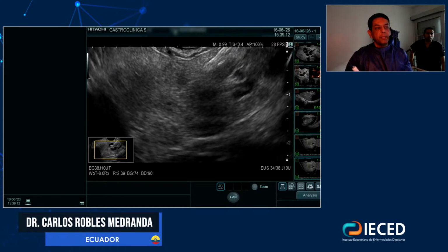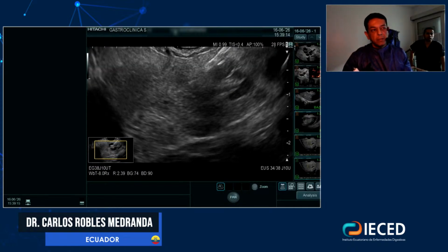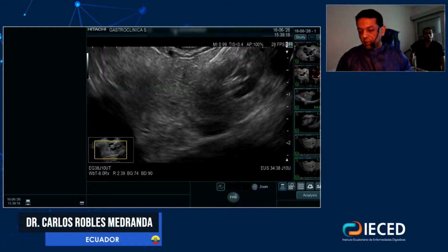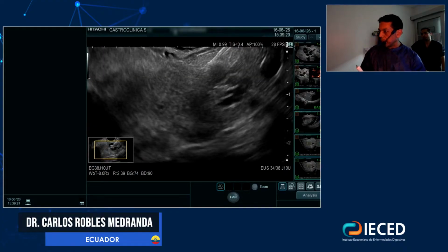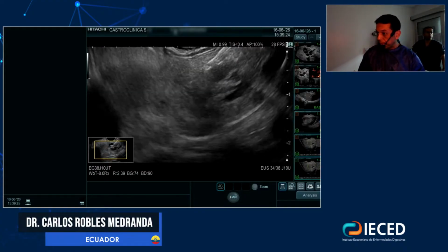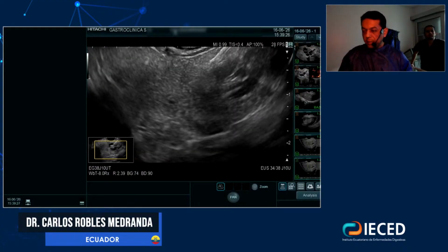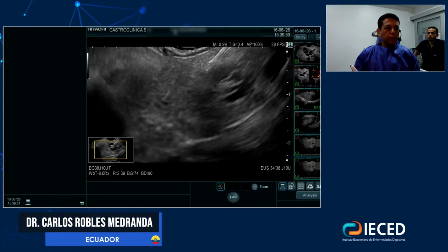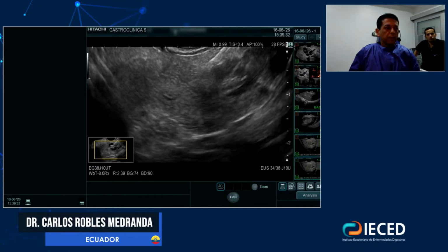And oops, no bleeding. So now I take the whole cystic lesion here inside, the liquid inside, which is difficult. So we need light because my team is there. Yeah, we have a good one.